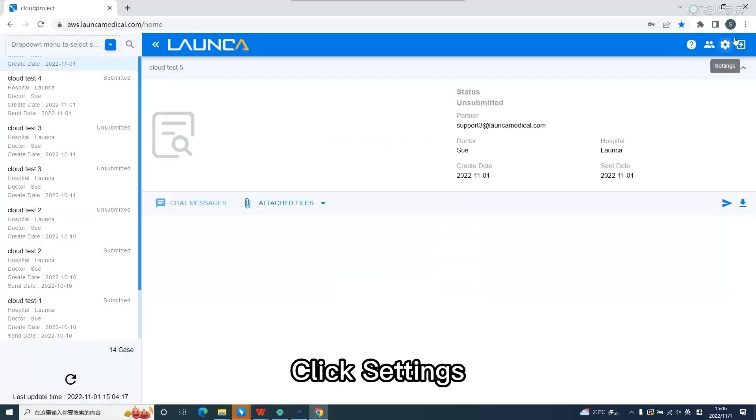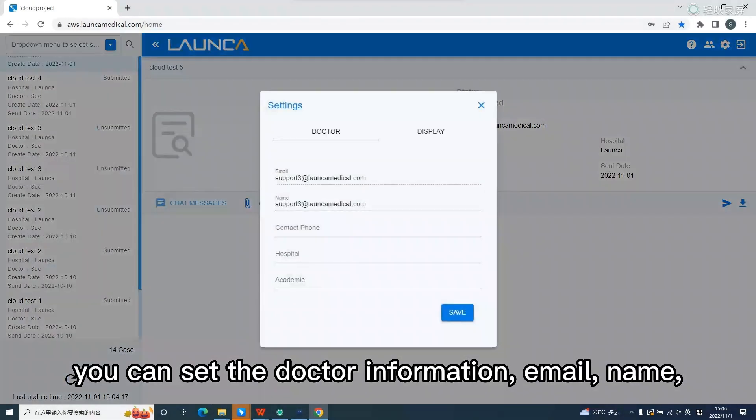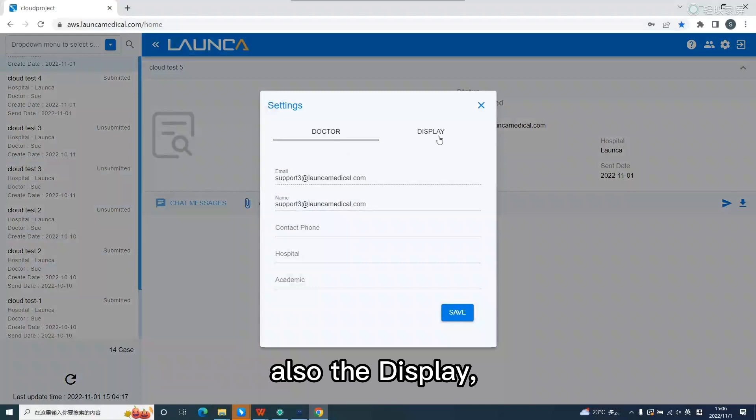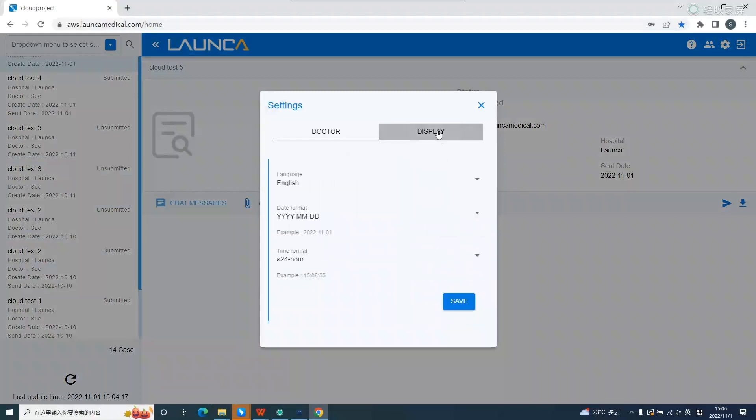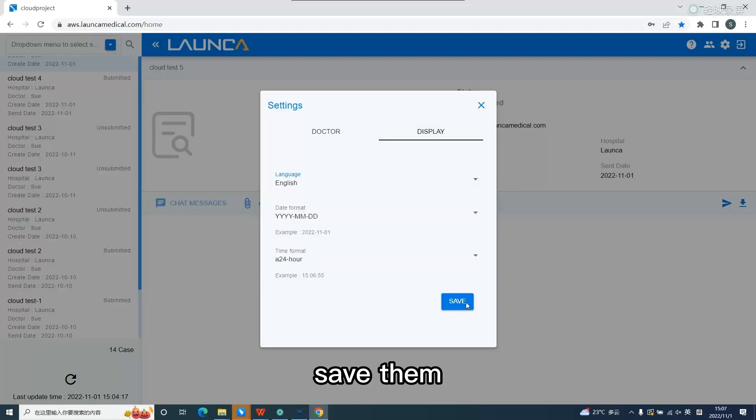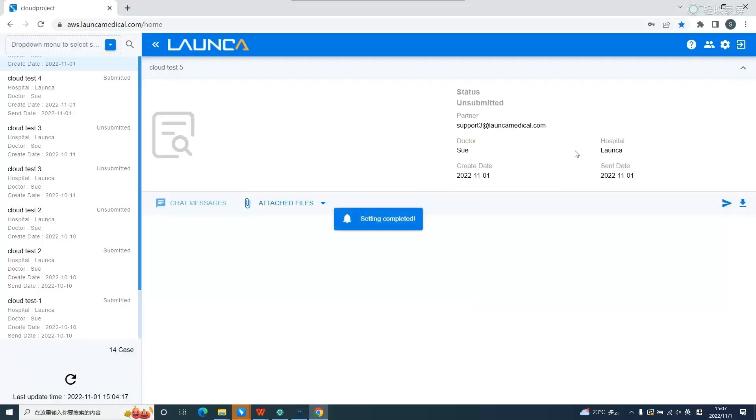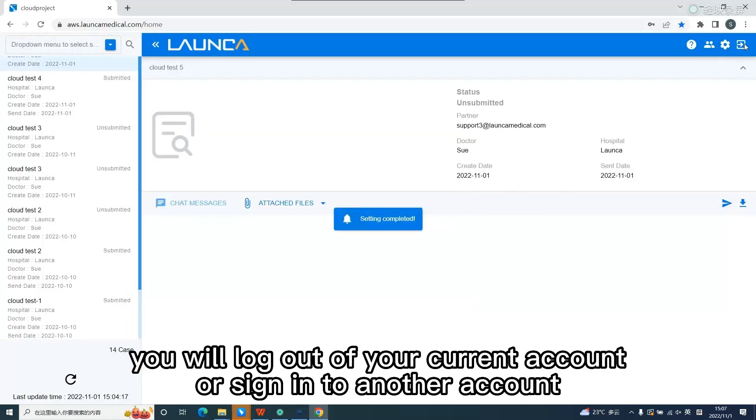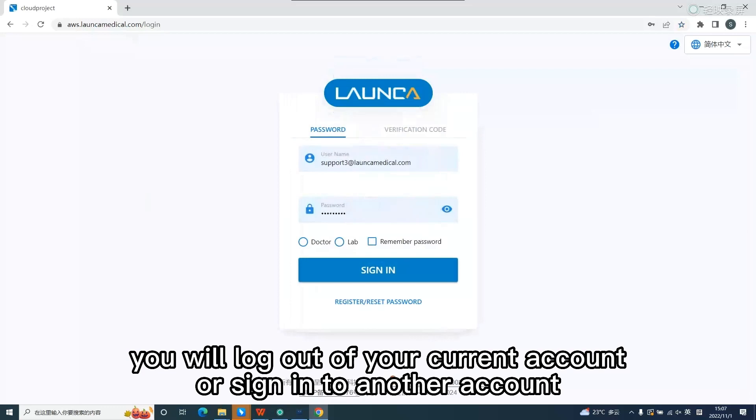Click settings. You can set the doctor information, email, name, also the display. Save them. Click logout. You will log out of your current account or sign into another account.